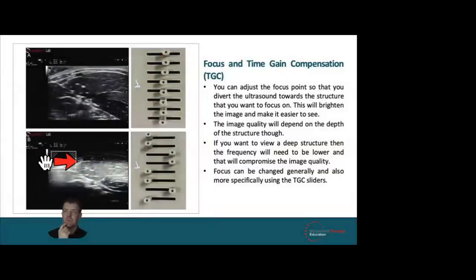Okay, and if you have a look at this one, so we've got a real bright area here and then darkness here and here. So look at those two. So those two are completely over to the left. So that means this top part will be black. This bit is really bright. So that bit is lit up. And then these bits dark. And then another bright bit just there. Okay. So you can see how you can manipulate the image to just highlight the sections, so the rows that you want to see. But when they're all left in the middle, that there is exactly the same image as that.